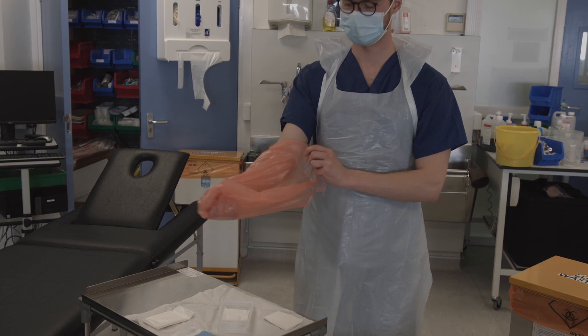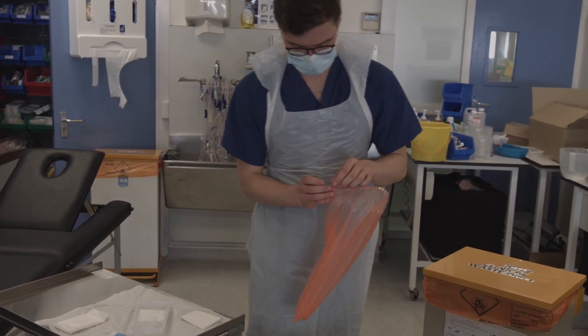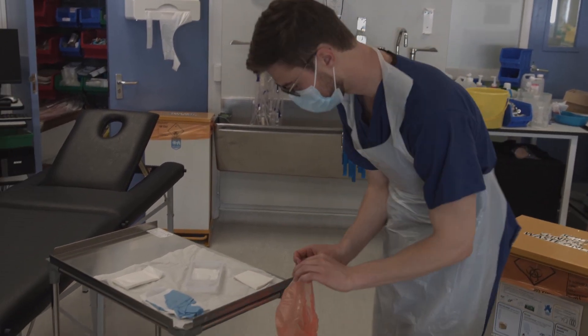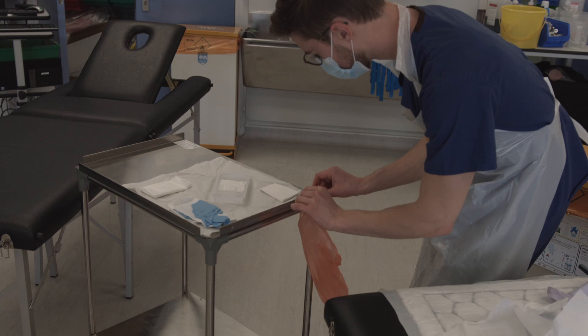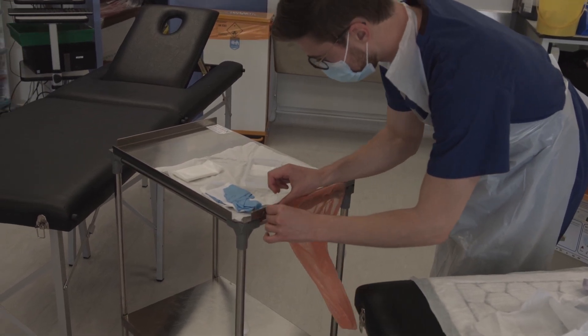Invert the bin bag, ensuring you do not touch the outside of the bag once inverted. This can be used for throwing out waste when you are wearing sterile gloves. Stick the bin bag to the side of the trolley nearest the patient.